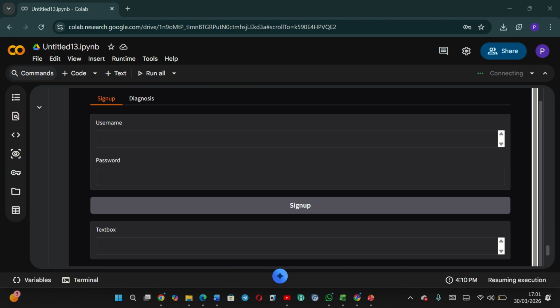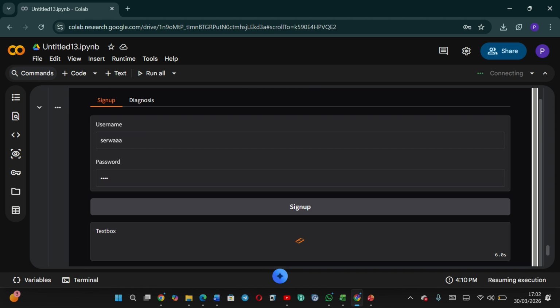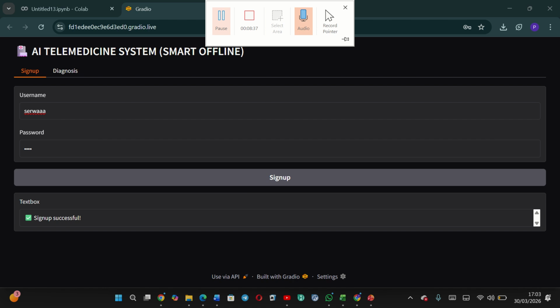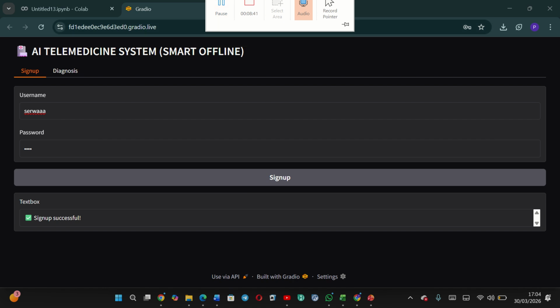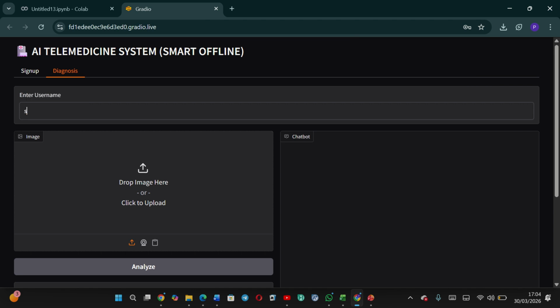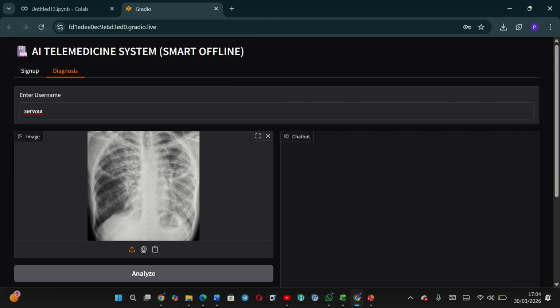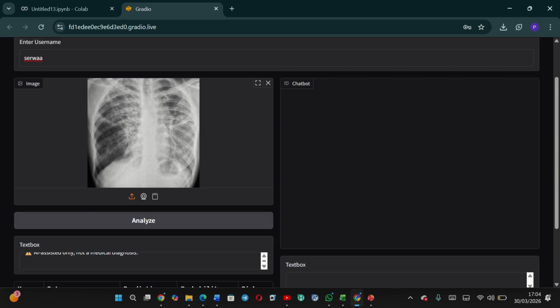First, when you see our interface, you have to sign up first. It says signed up successfully. So now we go to the diagnostic part. Enter our username, then upload my image, which is a TB image I got from the internet. So now our image is here, and we analyze it.